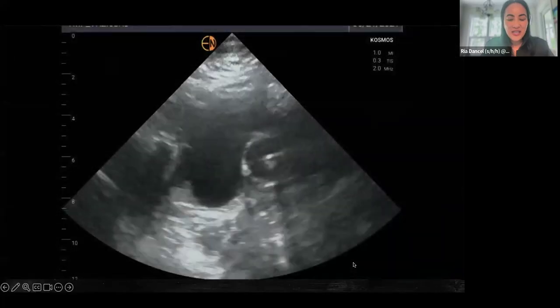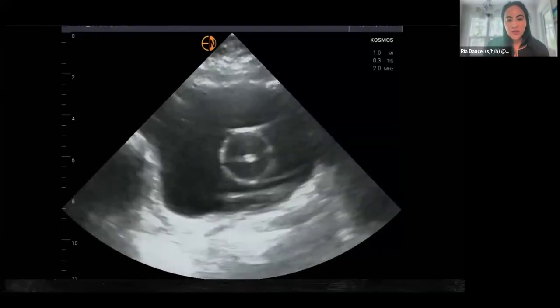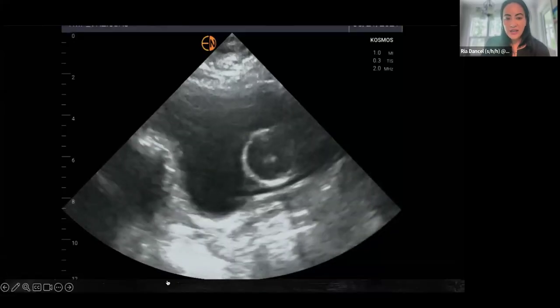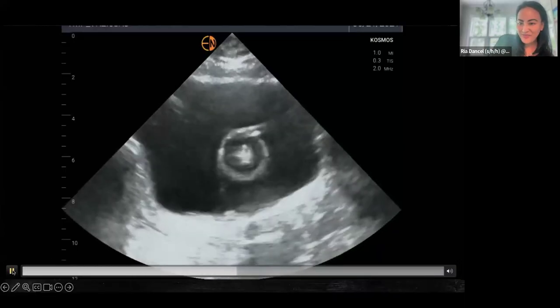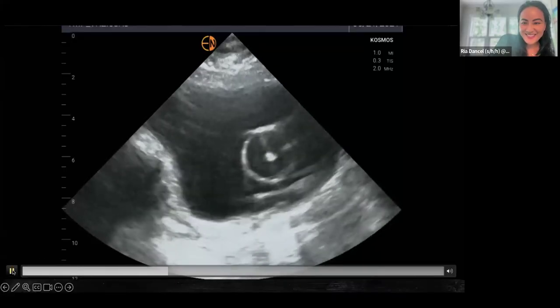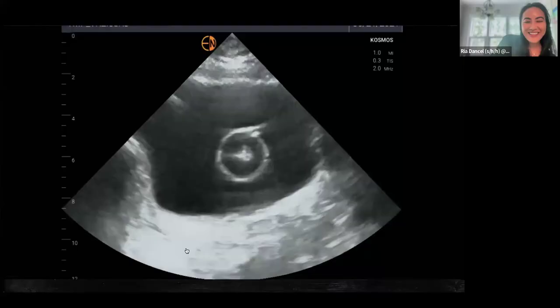And this is what we're seeing in the transverse. This is one of the pocket ultrasounds, so it's a little bit overgained here, but this is a transverse bladder. And I don't think it's that hard to figure out what's going on. Anybody want to tell me? I don't think the catheter is working. Catheter is not working. So thanks, Andrea.